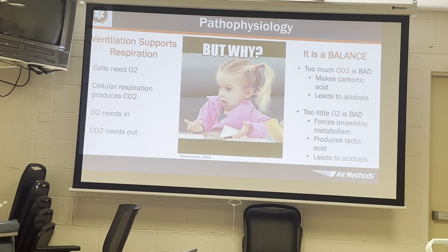So do you guys use CO2 monitoring a lot? Not so much? Okay. We have it. Super helpful, and we'll talk about that in a little while. But CO2 monitoring is very helpful in assessing someone's ventilatory status and how well we're clearing that. We can do the same thing with an ABG, it's just much more invasive, right? So we can see what somebody's CO2 level is through that.